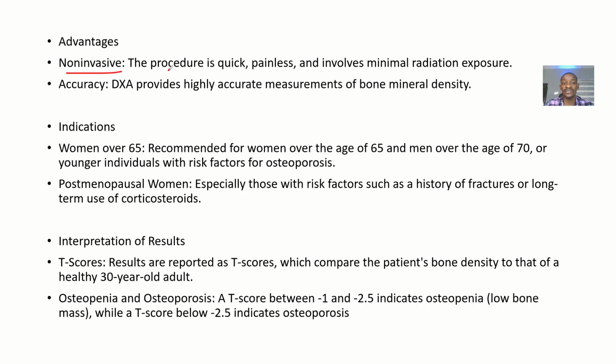Advantages: it is non-invasive, so the procedure is quick, painless, and involves minimal radiation exposure. There's no cut, there's no surgery. Accuracy: Dual-Energy X-ray Absorptiometry provides a highly accurate measurement of bone mineral density.